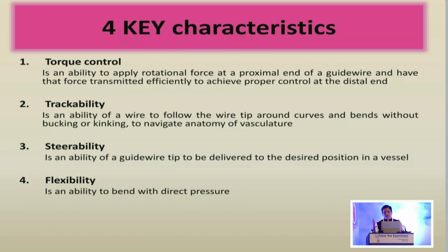280 to 400, it can be anything. So it can be 200 to 280 to 290 or something. So what I'm saying is when you have such a long guide wire, the torque control becomes a very critical point of a guide wire. Because if the amount of rotation you're giving is not matched by the tip moving, then the success of the procedure will be limited.